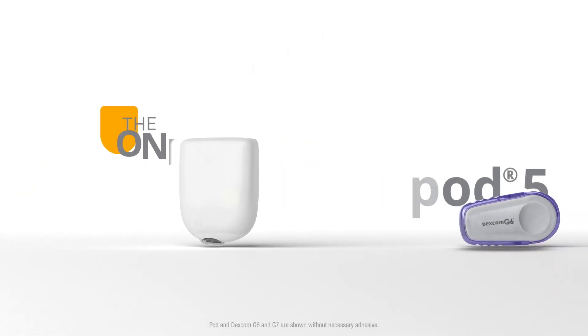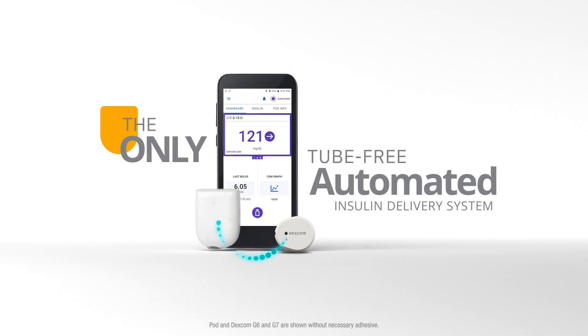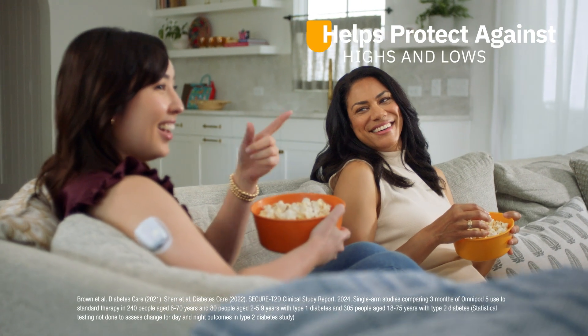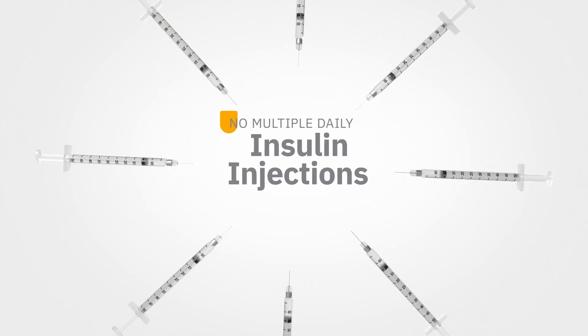Say hello to Omnipod 5, the only tube-free automated insulin delivery system that integrates with leading sensor brands. Working together to help protect against highs and lows, day and night, with no multiple daily injections.